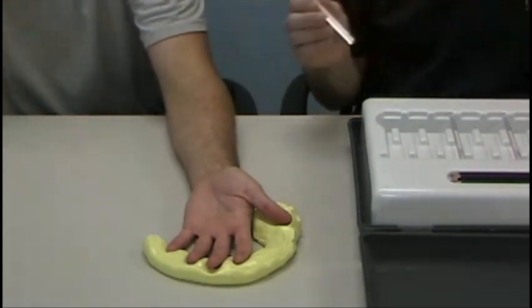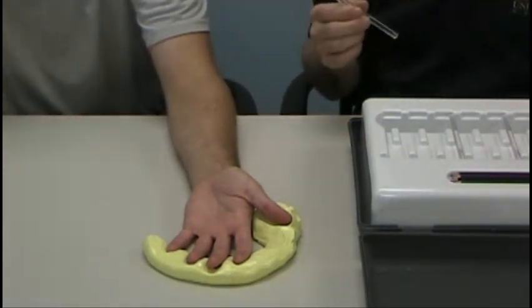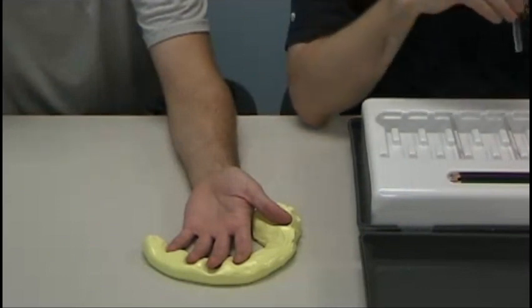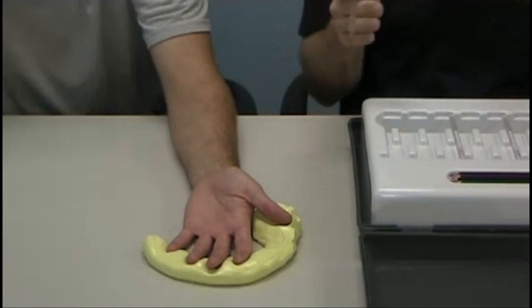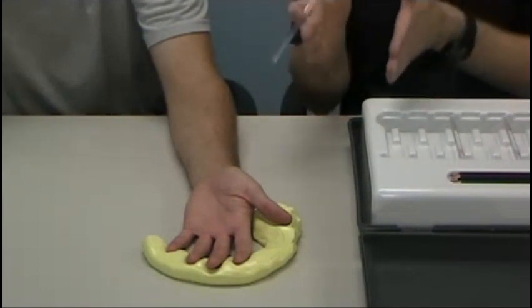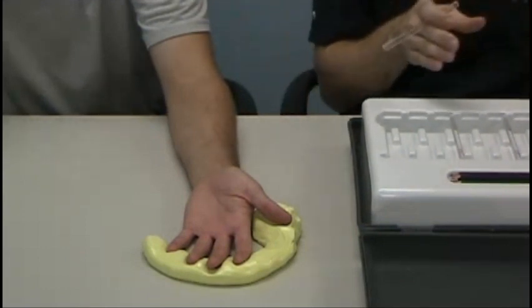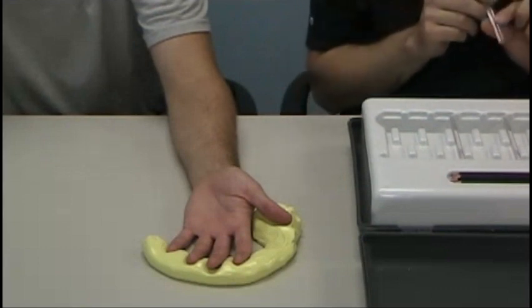There are several monofilaments. In the kits we have here, there are five monofilaments. These five monofilaments correspond to each threshold of testing, from diminished light touch to diminished protective sensation and so on.